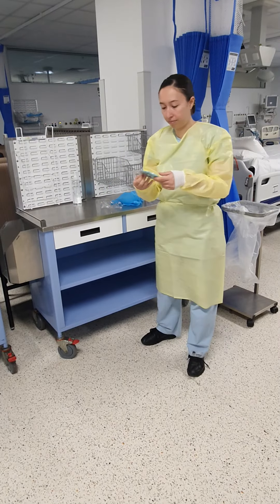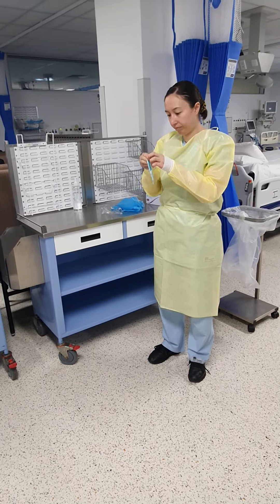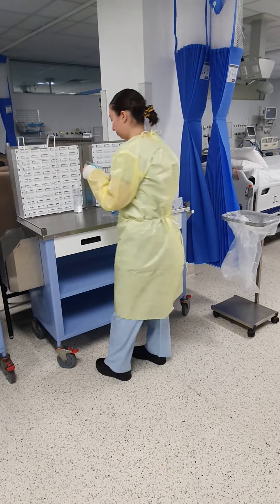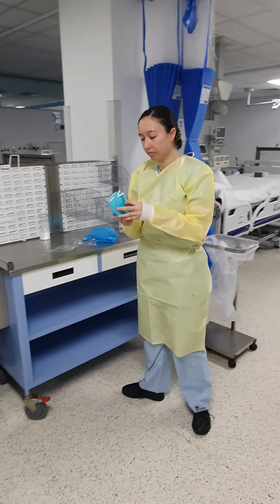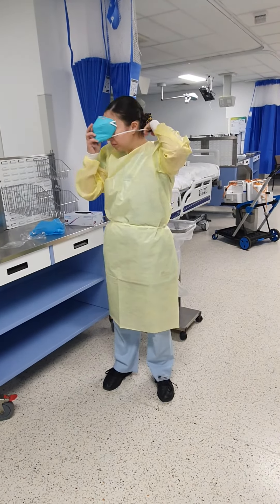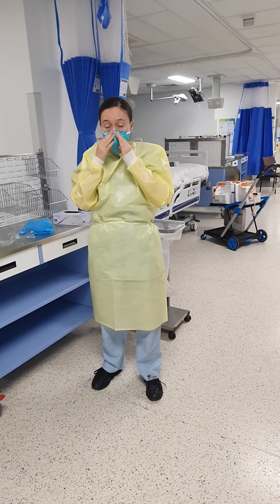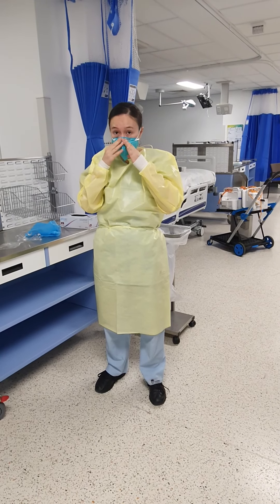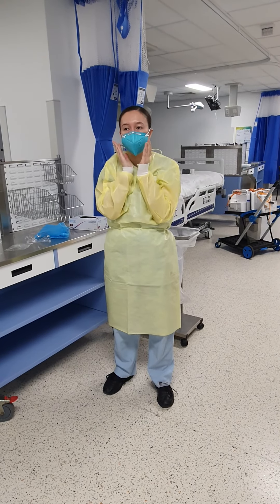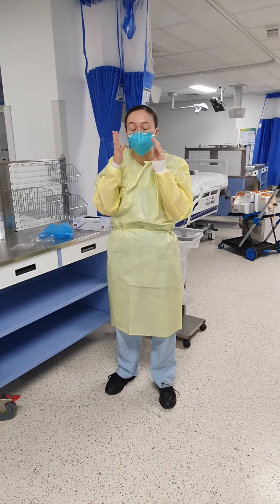Then you don on a mask. Make sure that there's no creases and make sure that it's fitted nicely and tightly to your nose. Breathe in and out. Make sure you can't feel any leak on the outside, and it should be sucking in in the middle when you breathe in.